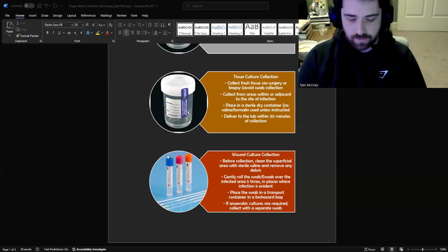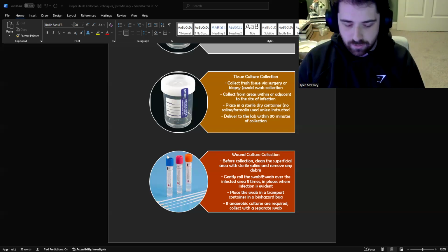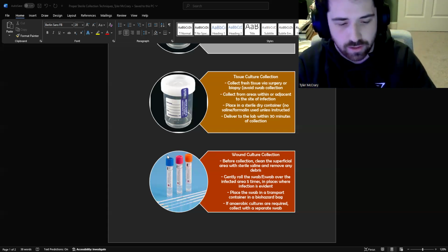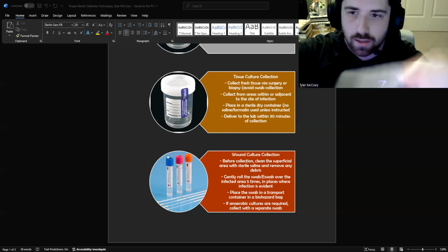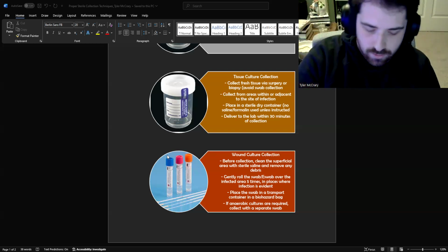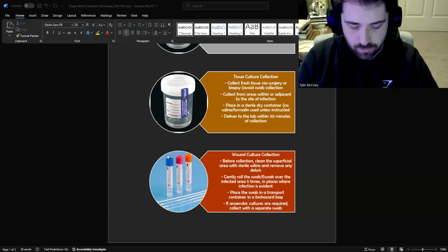So I do have another collection kit, and this one you can actually see the diluent in it. So this is actually used for COVID-19 testing, but I brought it as an example for the diluent. As you can see, it comes with a swab and a container with diluent inside. And let's just pretend this is for a wound culture.